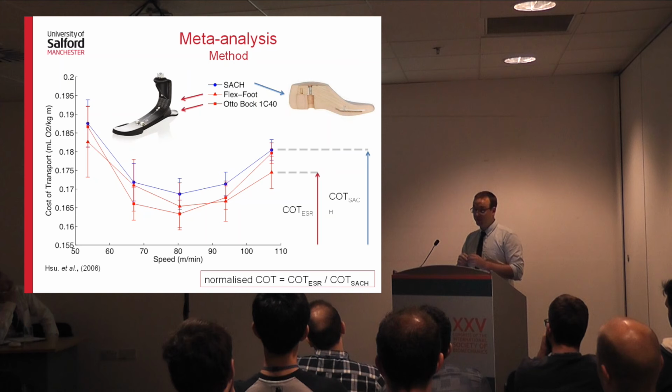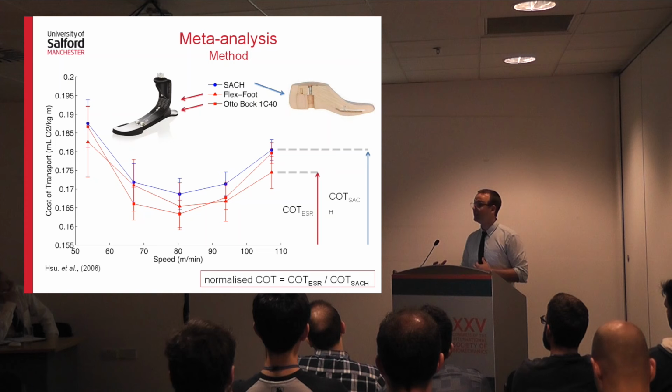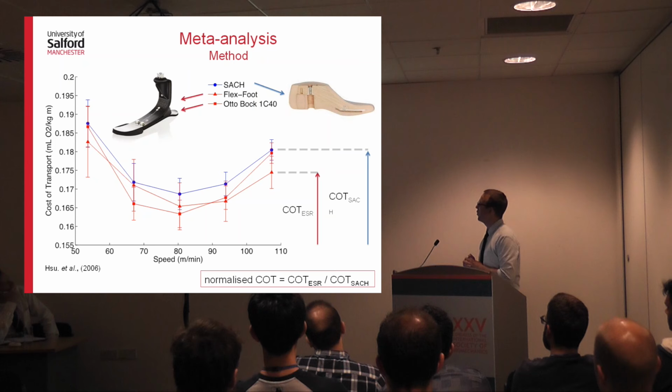And the reason we did this is the SACH foot's fairly consistent in design by different manufacturers, and it provided a baseline that was often included in the studies. So if you like, we're looking at the percentage cost of ESR feet compared to the SACH foot. So we use this as a way to normalize our data. So the equation is at the bottom there, and I call that normalized cost of transport.